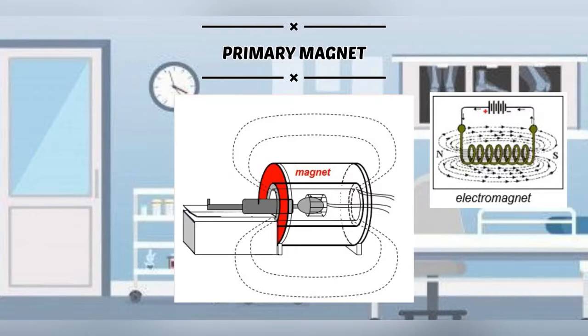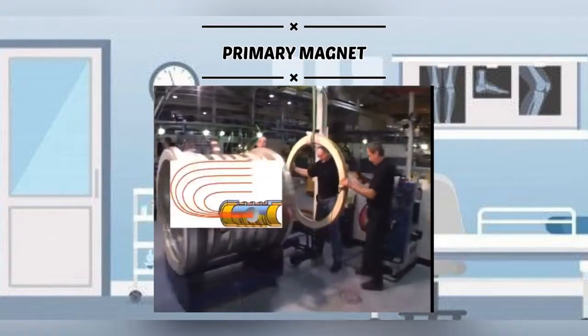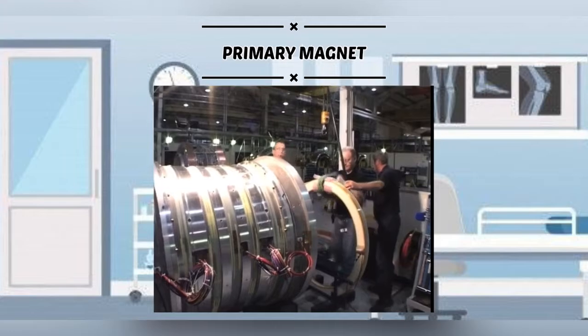The magnets used for medical imaging typically have a strength of 1.5 to 3 Tesla. This is about 300 times that of a bar magnet. It consists of about 200 kilometers of wire and weighs about 10 tons.